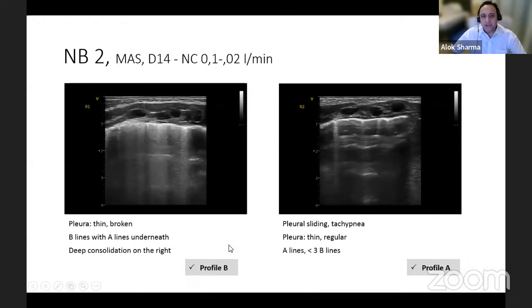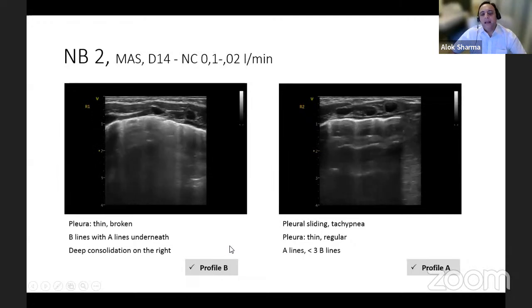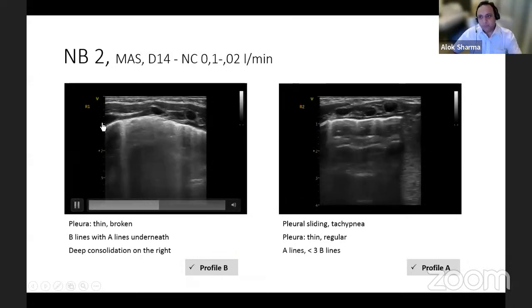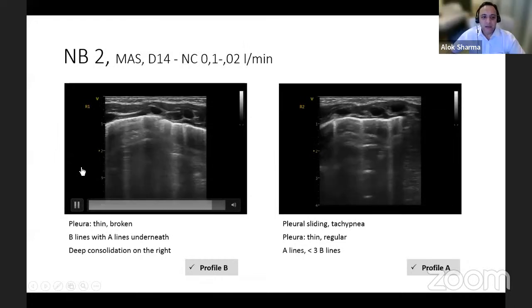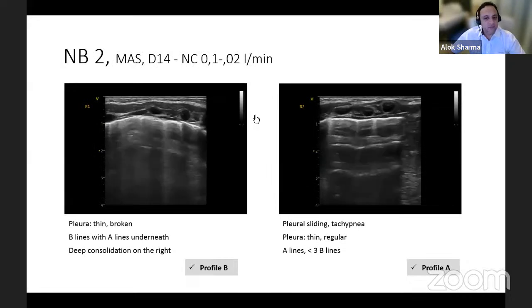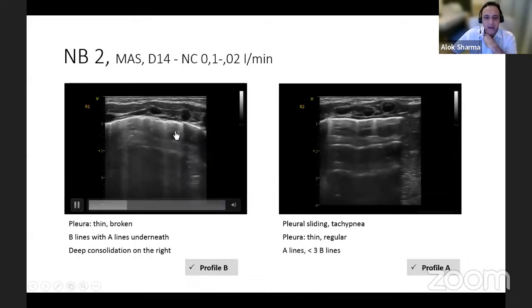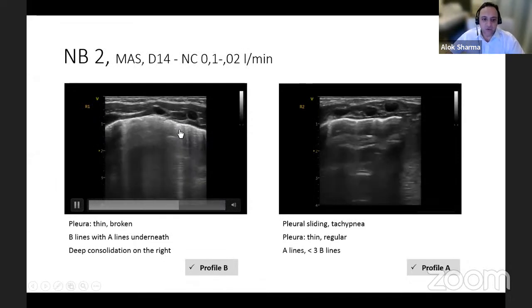The beauty of the GE machine, the Vivid that you use, is you do not have to adjust the focus to be at the pleural line, in that it auto adjusts, which is really remarkable. I can see a marker there at 2, but actually the new GE Vivid doesn't need the marker to be anywhere. It auto adjusts to pixelate to the best quality. And that's why you can see the lungs in their entirety right down to the bottom.